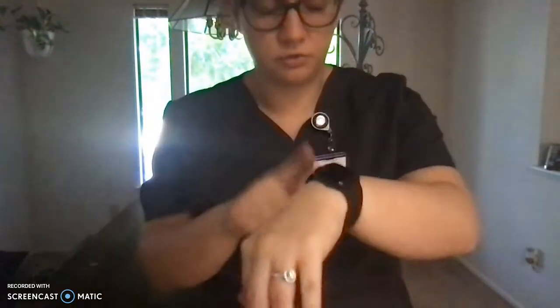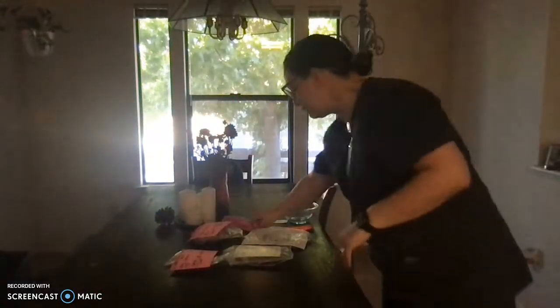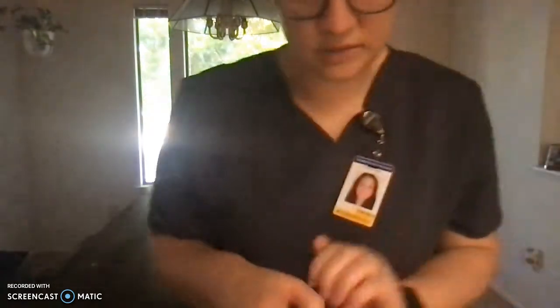I'm going to be performing the IV fluid and medication administration video for you today. First, we're going to start off with hand hygiene, making sure that we're washing our hands for at least 20 seconds, taking off all jewelry or watches, and then we're going to go ahead and don our gloves.